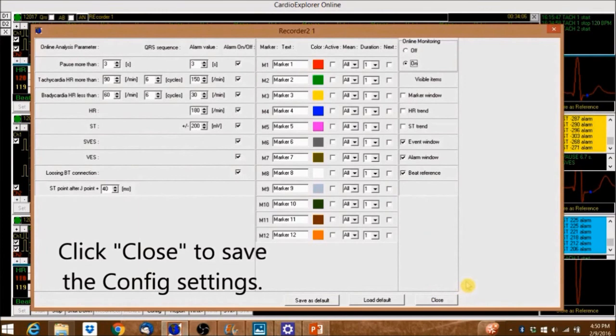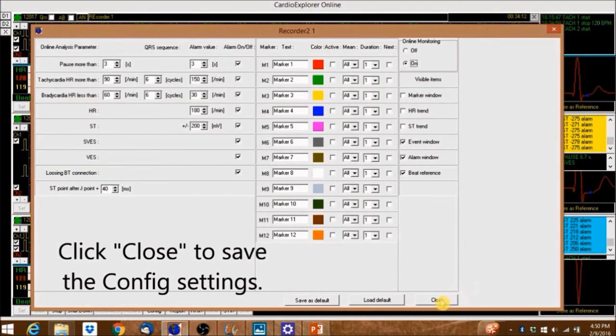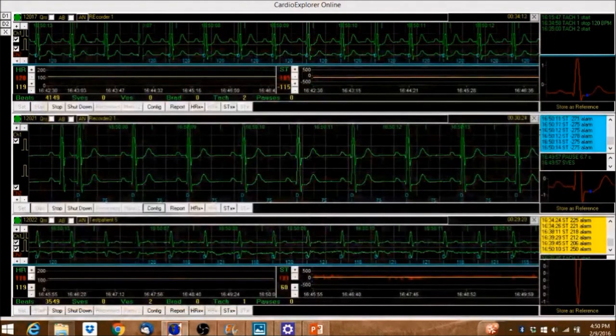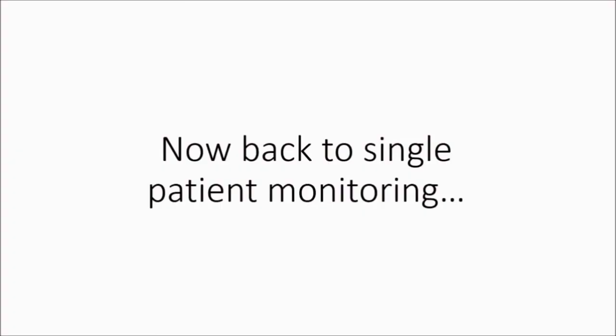Click close to save the config settings. Now back to single patient monitoring.